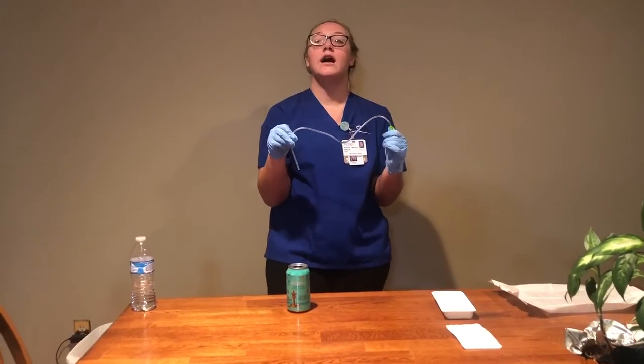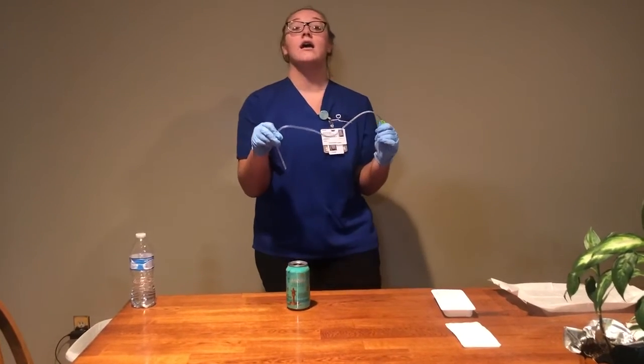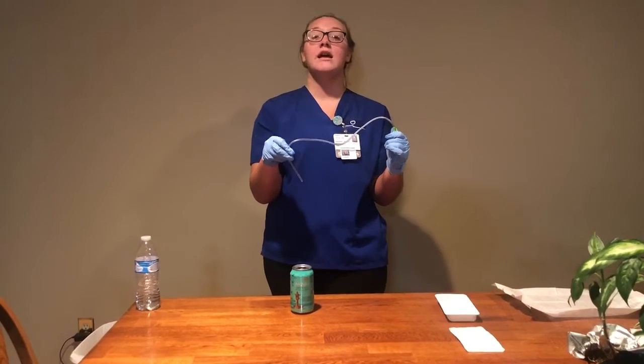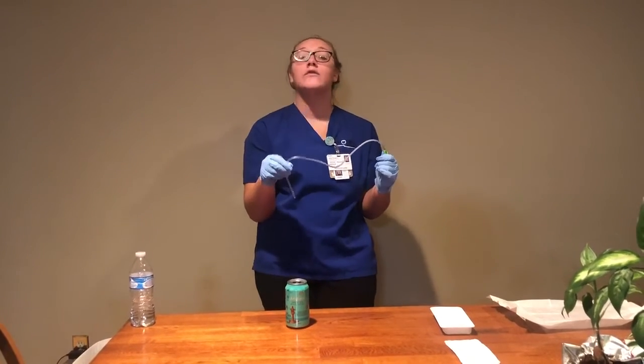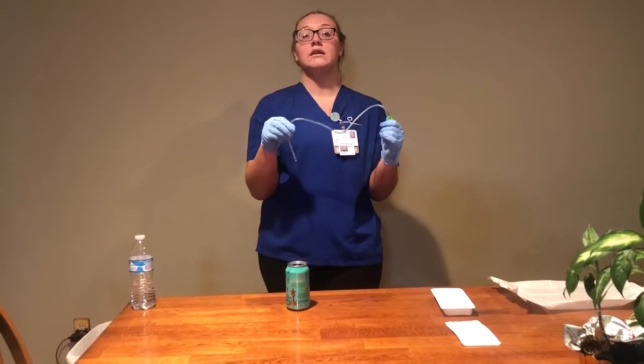And then after that, I would make sure that if I was to do it again to resuction, I do not do it more than 3 times at a time during a suction episode. And then I would also have my patient hyperventilate, cough, or deep breathe before suctioning to help breathe and get some breaths in.